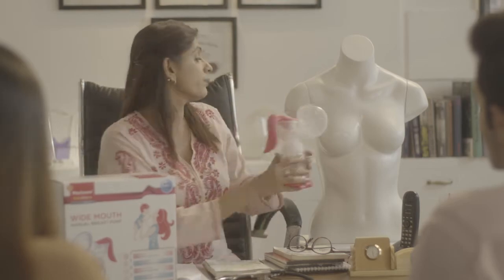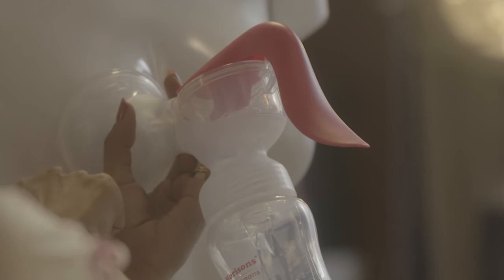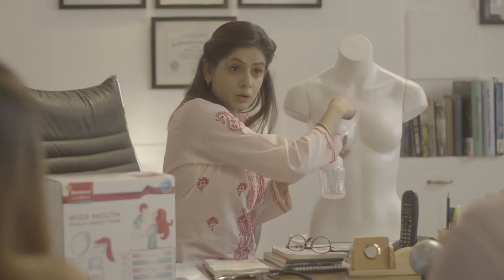Then massage your breast gently and squeeze out a little milk. Now place the breast shield on the breast tightly — make sure there is no air escaping, or there will be no suction.